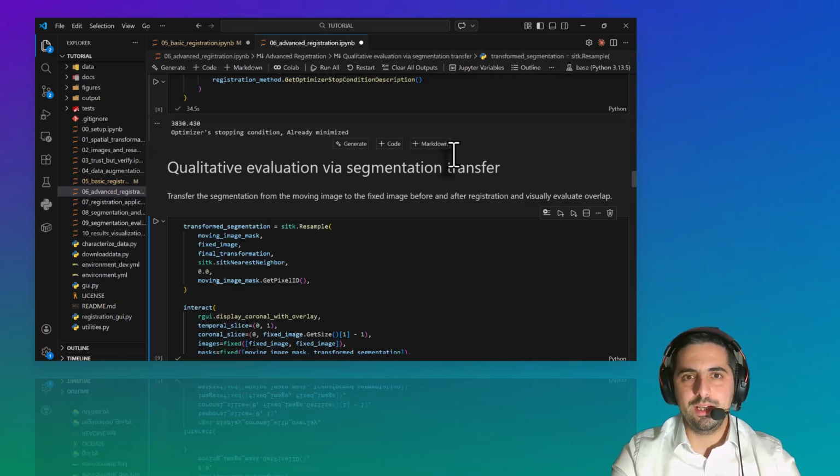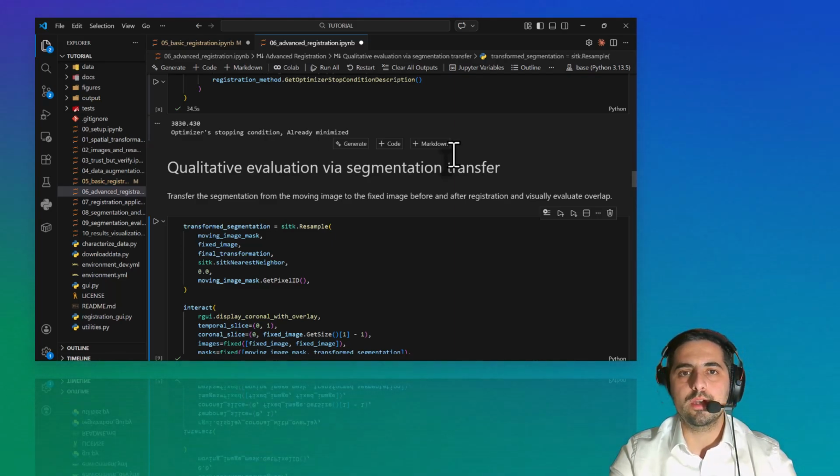I hope it was clear for you. Understand that this field is not so trivial. Again, this is a very important thing to understand: a displacement field is completely different when we work with a point cloud and when we work with a grid. With a point cloud, we can continue working with samples, and we just need to estimate the kernel and the weight for the non-rigid displacement.